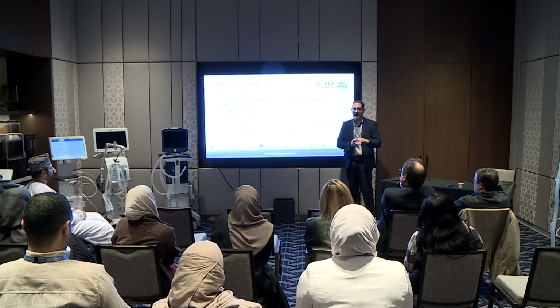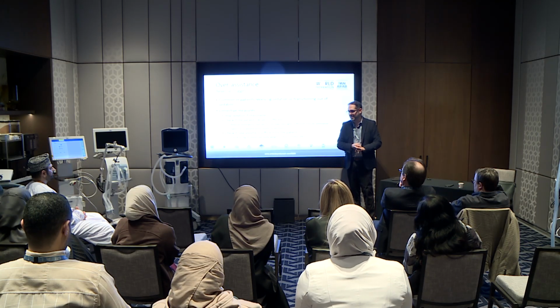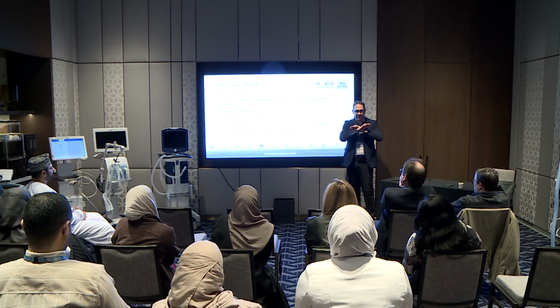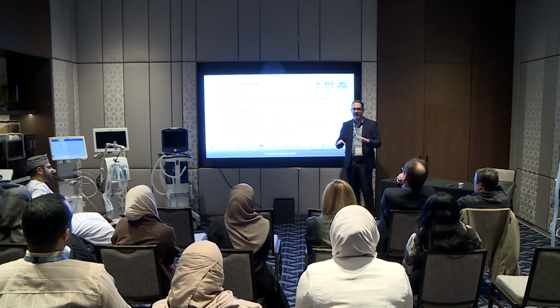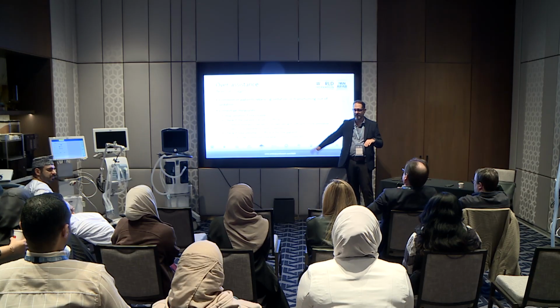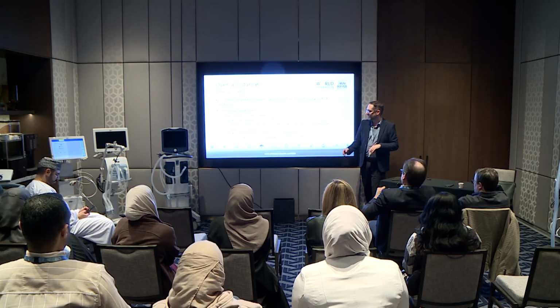Okay, so having said that, I have seen almost as many patients that when I reduce the rate, they just have no drive. So unless the ventilator is stimulating them, they don't do anything. You try pressure support and they just are apneic for 12 seconds. So check if the tidal volume also is sufficient.